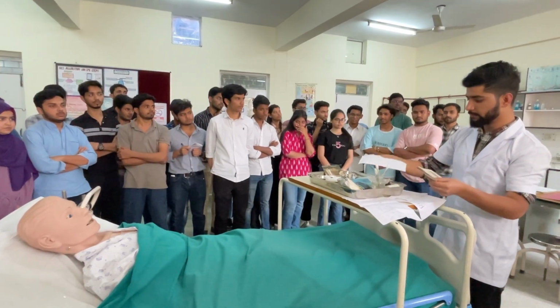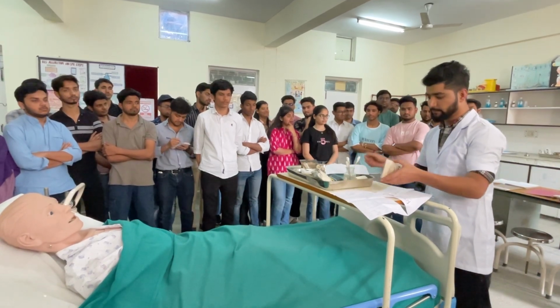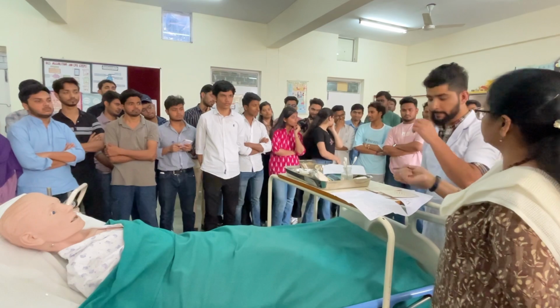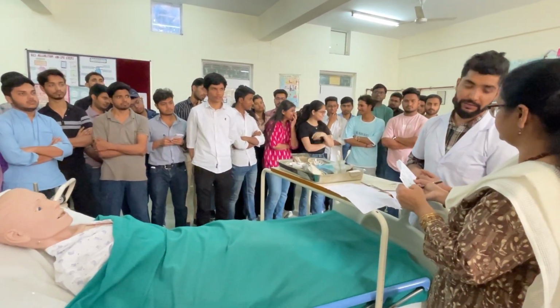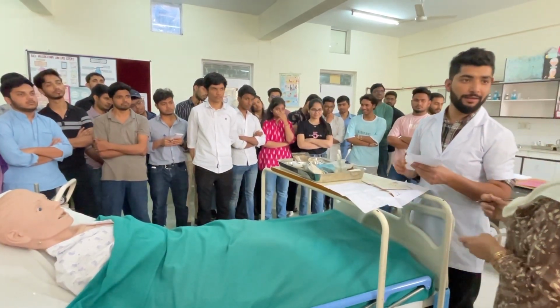Is it a clean procedure or a sterile procedure? So this is a sterile one. This one is sterile or a clean one? So you have wasted one sterile.